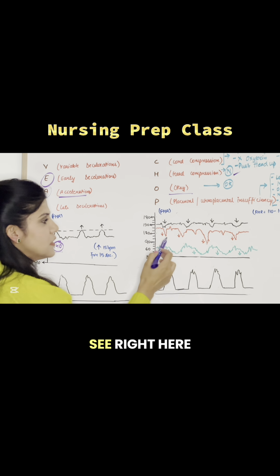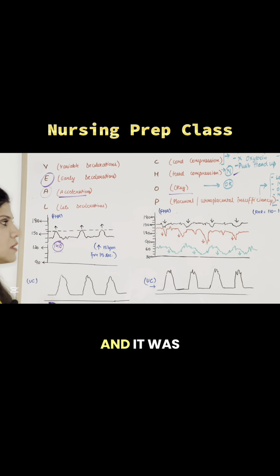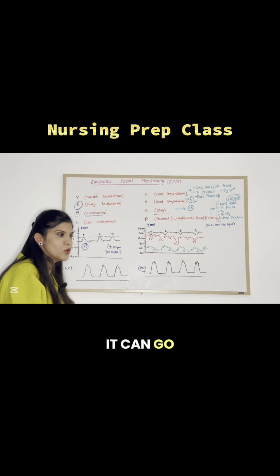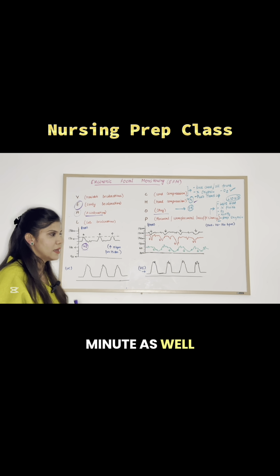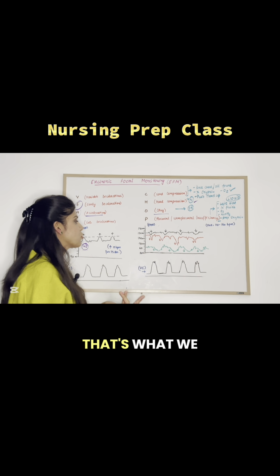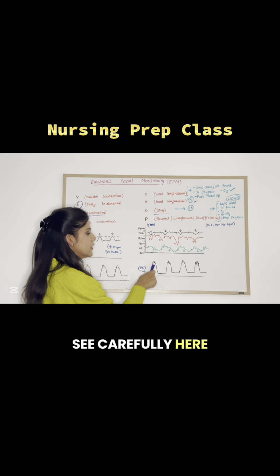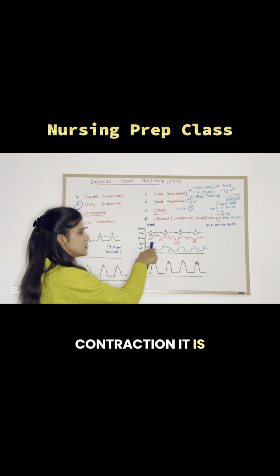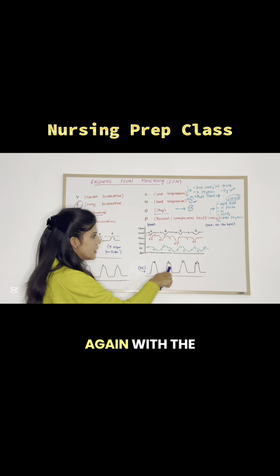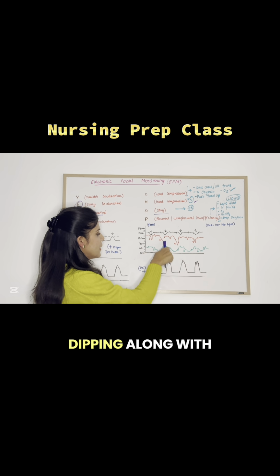So if you see right here, the heart rate was decreasing or dipping way too much, and it was even less than 100 beats per minute. It can go low up to 70 beats per minute as well, or it can stay over there for a very long period of time. That's what we call variable deceleration. And if you see carefully here, with the uterine contraction, it is dipping, the uterus relaxed, it got okay. And then here again, with the uterine contraction, it was not dipping along with it.